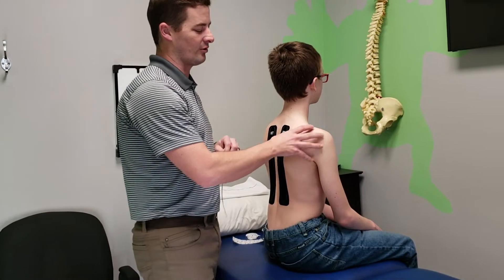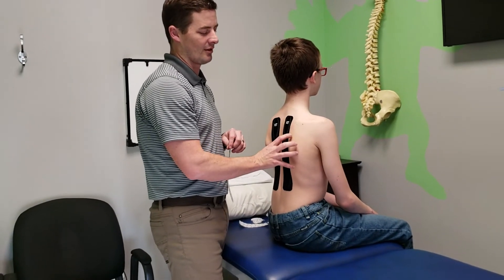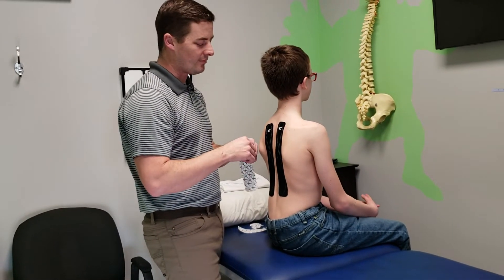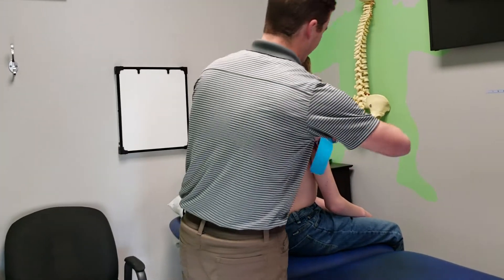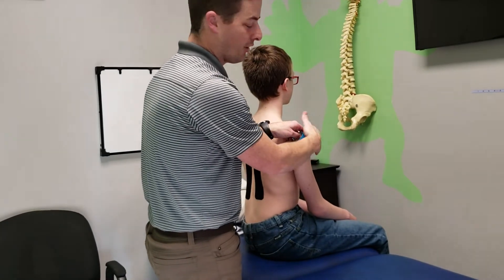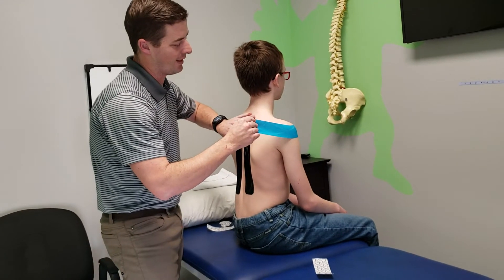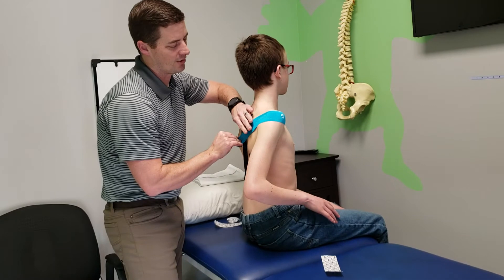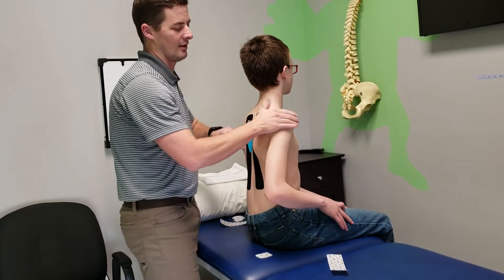A lot of times with scoliosis, the shoulder on the prominent side will go forward. So a way to give a little bit of feedback for that — I'm going to put the tape a little bit on the front, then he's going to pull the shoulder blade back, and I'm going to put about 80% tension on that one.